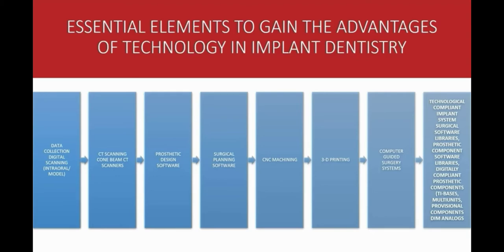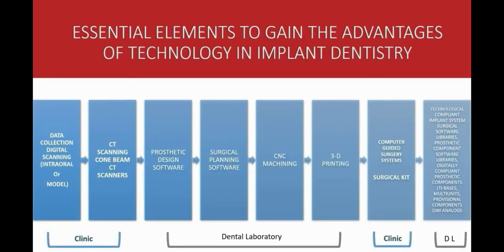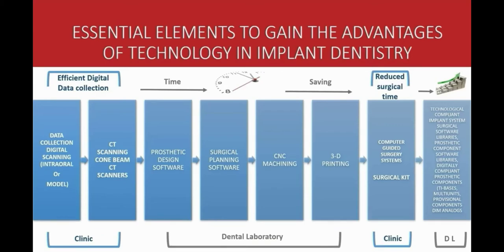The list is long. Now allow me to simplify this for you by pointing out that in modern digital dentistry today, the dental laboratory takes a major role in digital technologies, such as the prosthetic design software, surgical planning software, CNC machining, milling, 3D printing, and prosthetic components. This workflow will be both time efficient and cost saving.